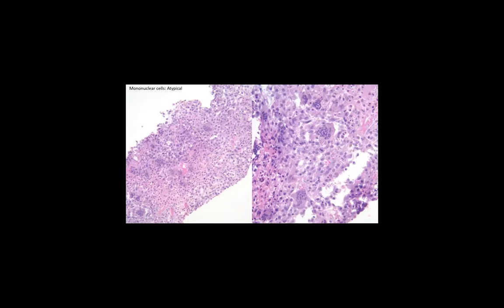So the last differential we're going to talk about quickly is this pattern. This is an 80-year-old with a thoracic spine mass, and we got a core biopsy. Even at this power, you can see that there are giant cells in the background. Again, we see giant cells in this lesion, but unlike the other cases we've seen, the mononuclear cells in this case are very atypical. They're pleomorphic, they're hyperchromatic. There's a lot of mitotic activity, including atypical mitoses.